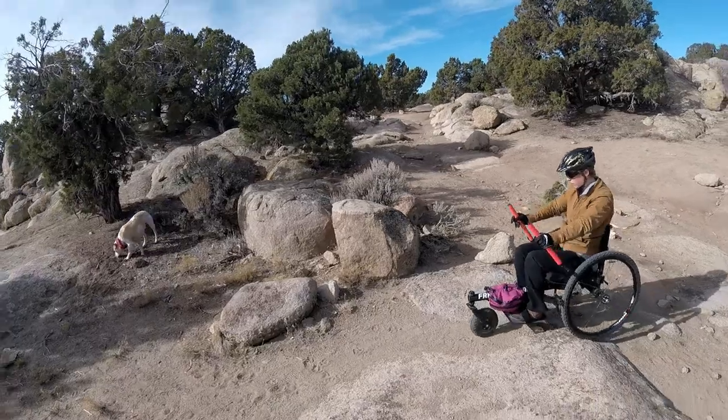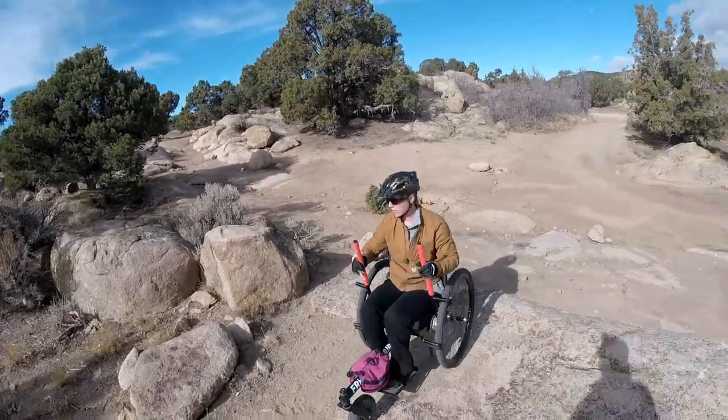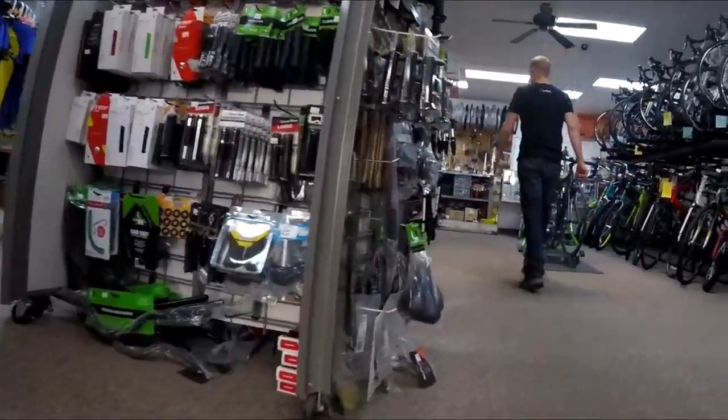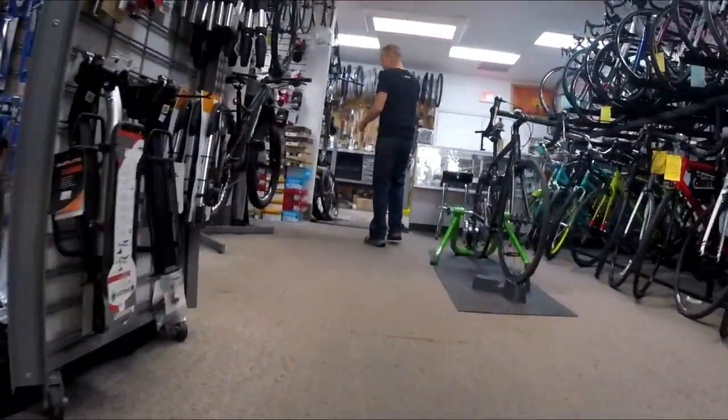Hello and welcome to another episode of It's a Grit Life. The Grit Freedom Chair is often called a mountain bike for your arms. Its moving components are mountain bike parts, which not only enhance your trail endeavors but also make it easy to have basic maintenance and repairs done locally, even while you're traveling.